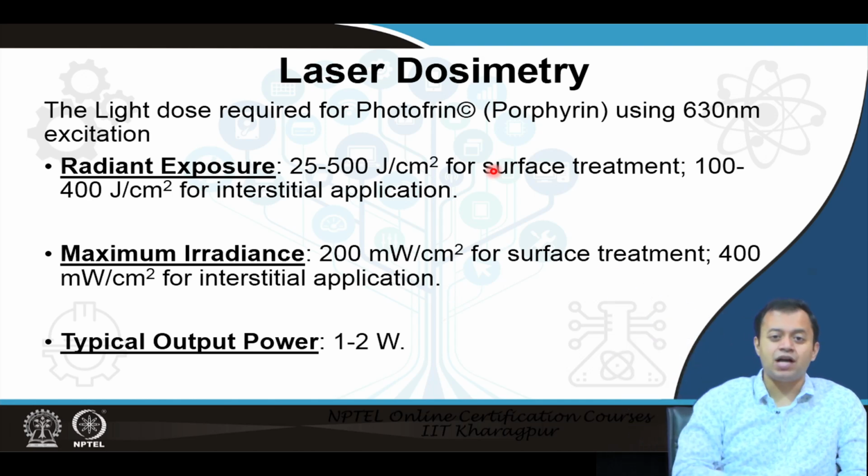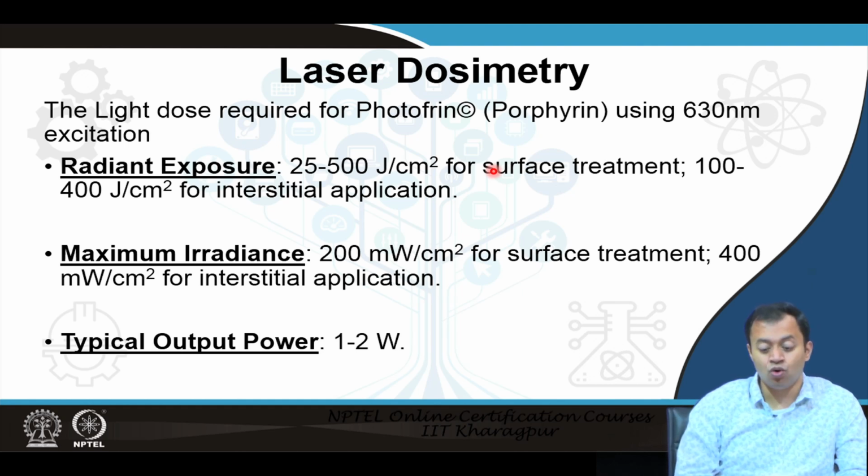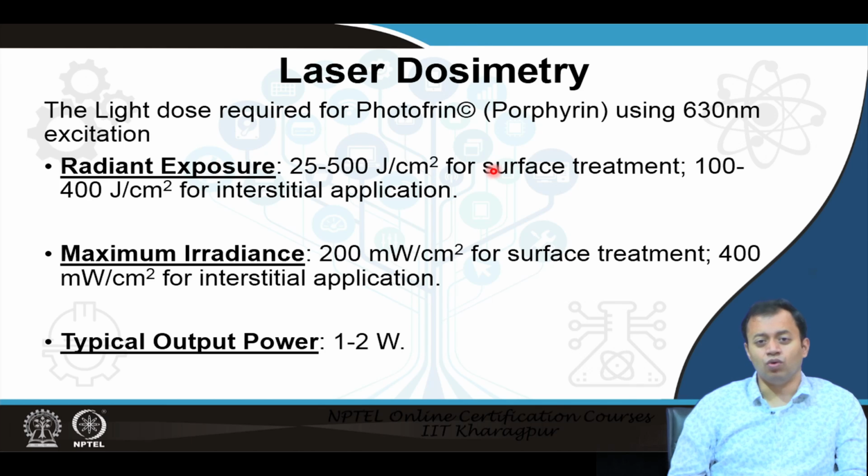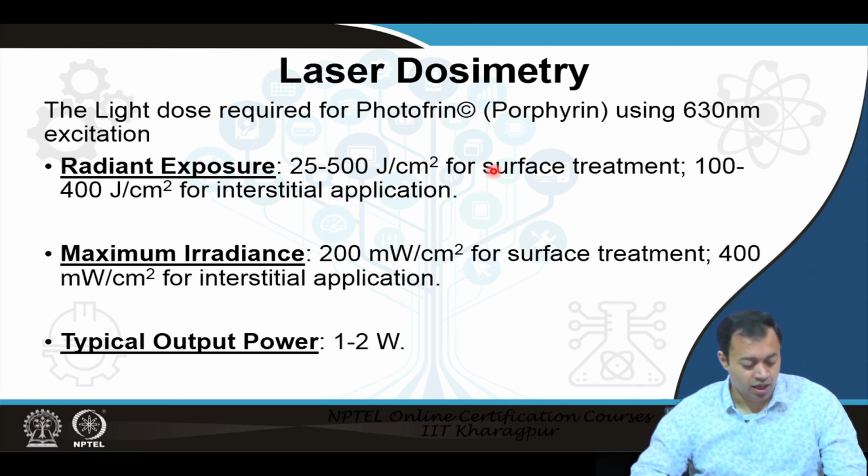So this actually exists. The rest of the time I am encouraging you to develop your own dosimetry by working first on a petri dish and then moving on from there to a mouse maybe, and then finally doing preclinical studies and then going forward to treat actual human beings.